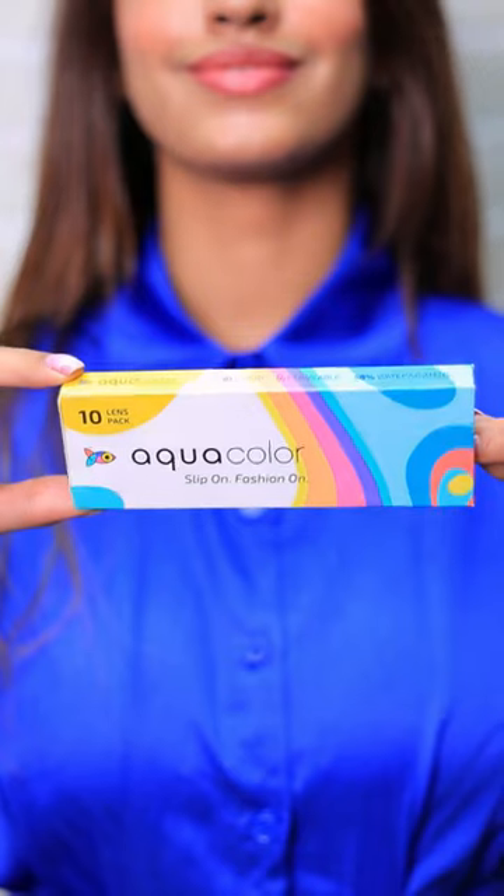Repeat and you are done. These aqua colored lens by Lenskart are super comfortable. Gives UVA and UVB protection with high water content and clear vision.